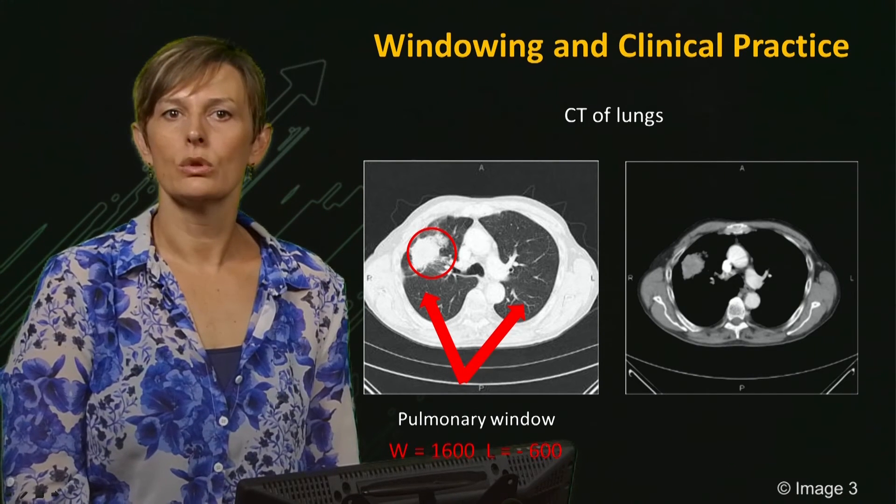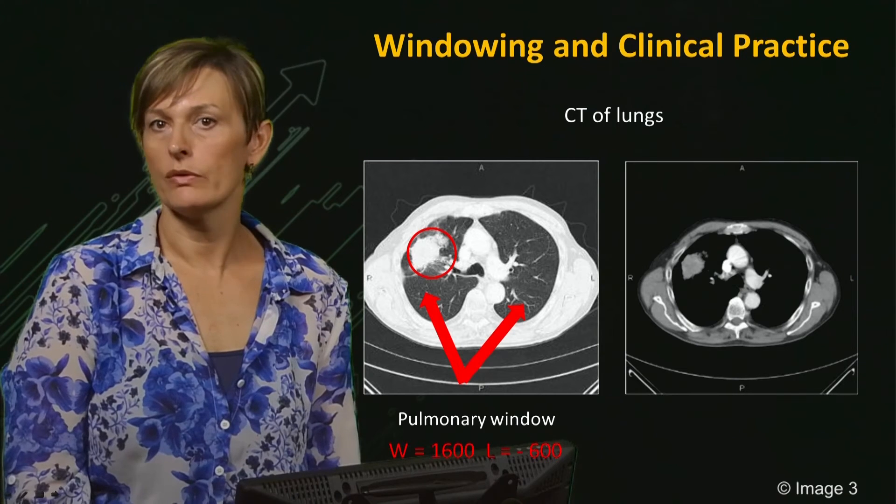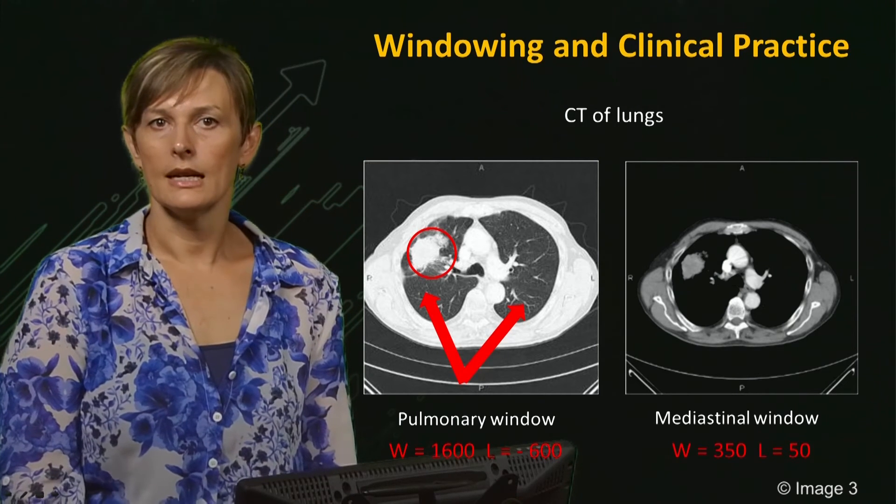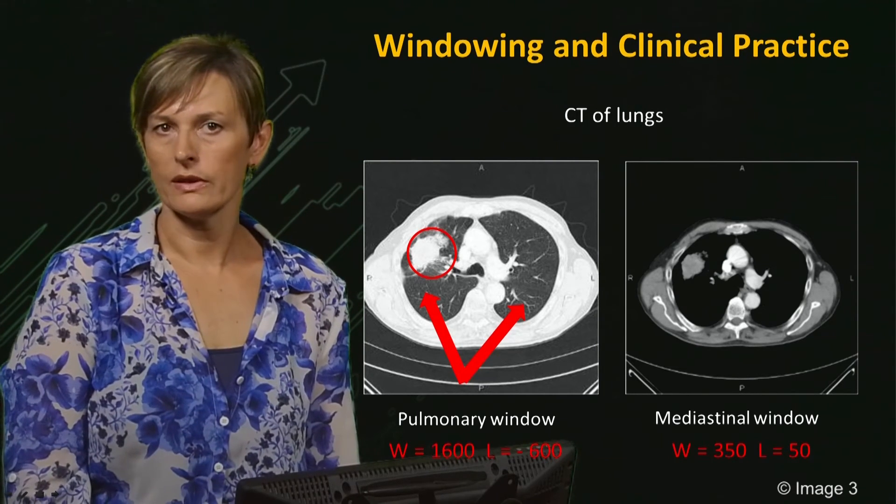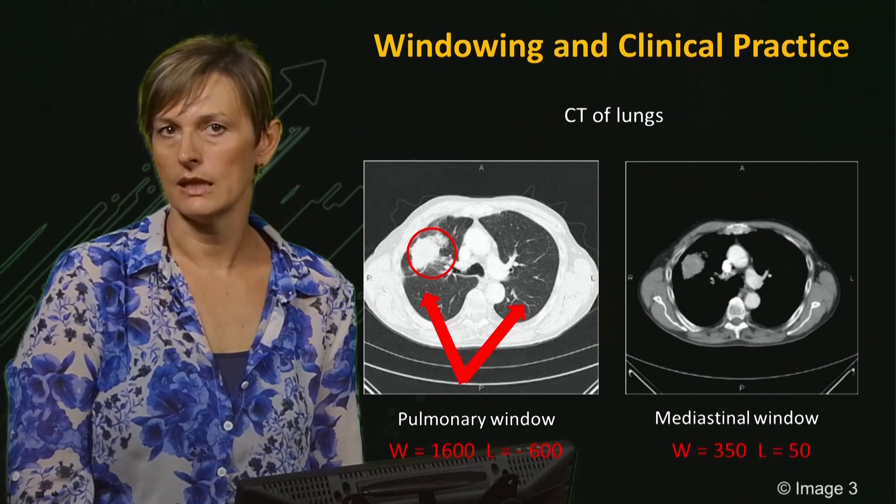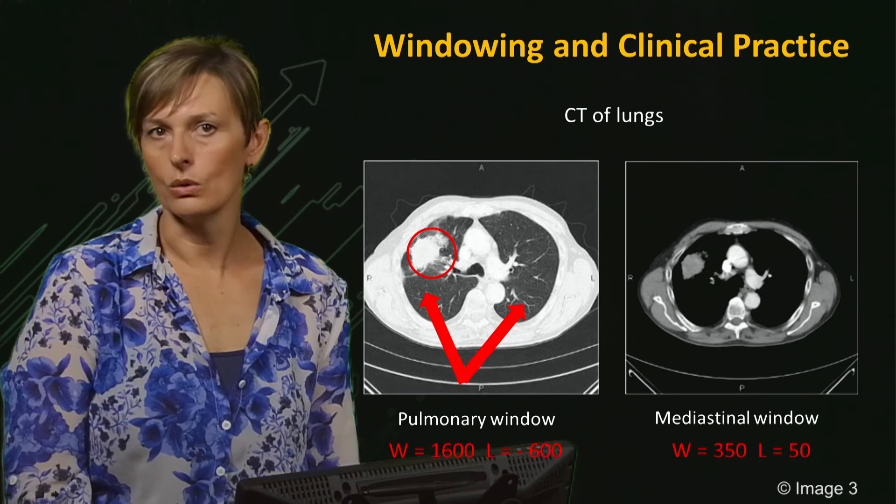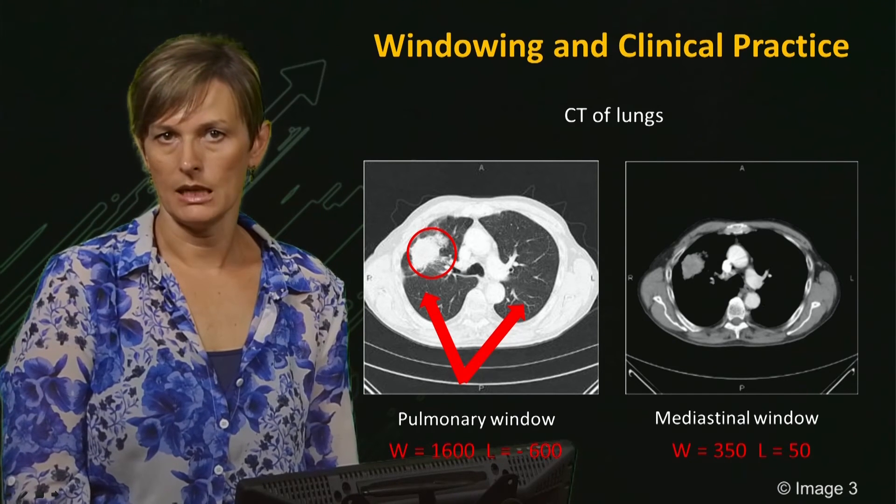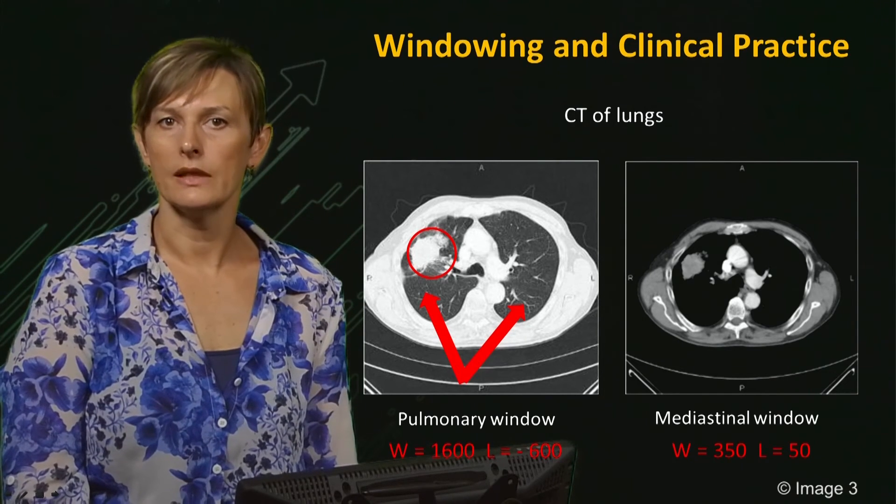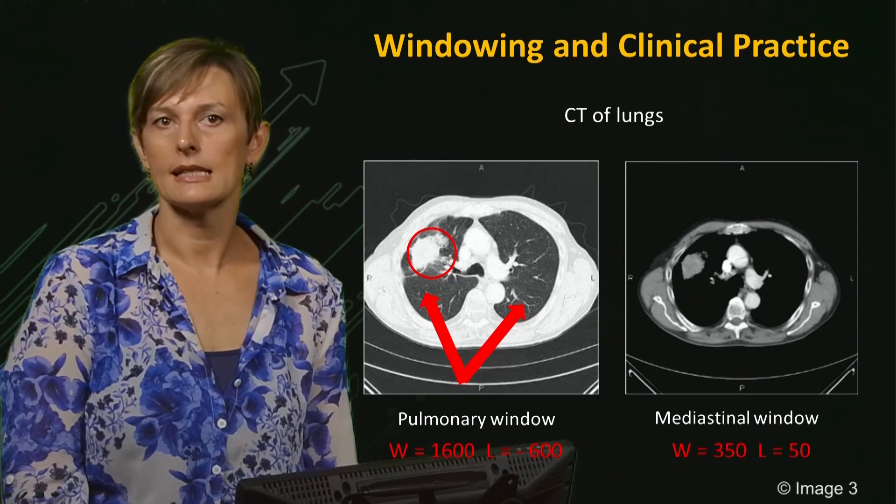Now, let's have a look at the same image but taken with a different window. W here was set to 350 and L was set to 50. As you can see, just by changing the window values, the lung has disappeared. But now, in this new window, we can clearly see a tumor.